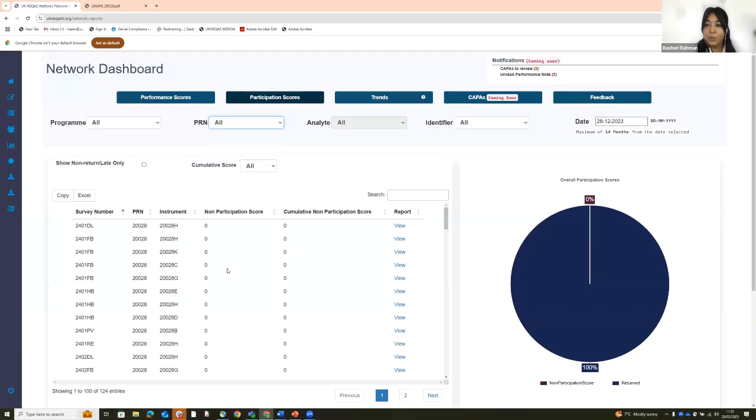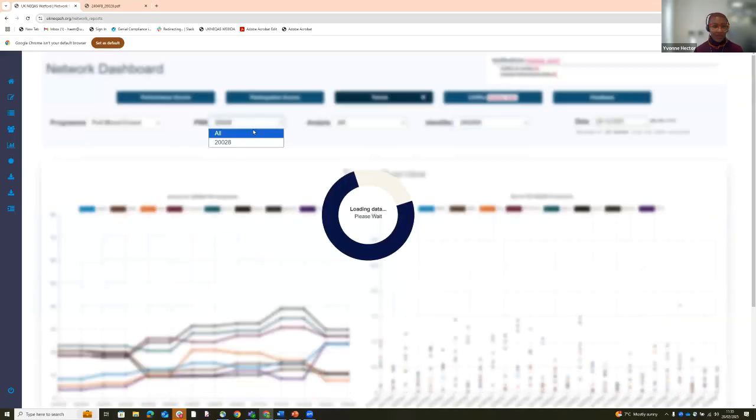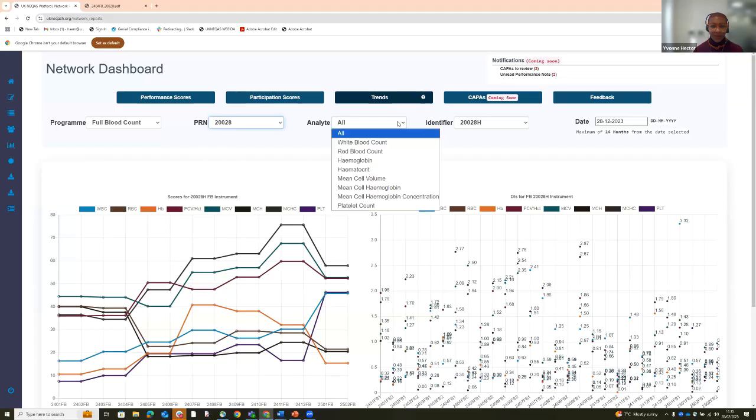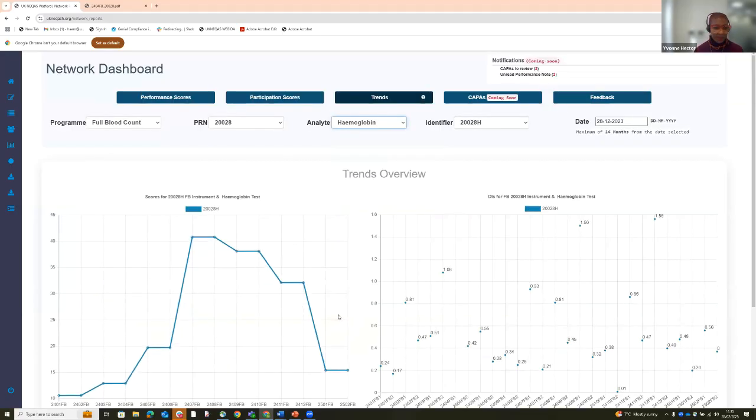And another question is from Susai Alphonse. If my dashboard shows 2% and I want to check which parameter is making an issue, is it possible to pick up from the graph or do I need to get it from the filter options? So if you were in trends, let me just go again to my machine. So for example, hemoglobin. Could you just repeat the question again?